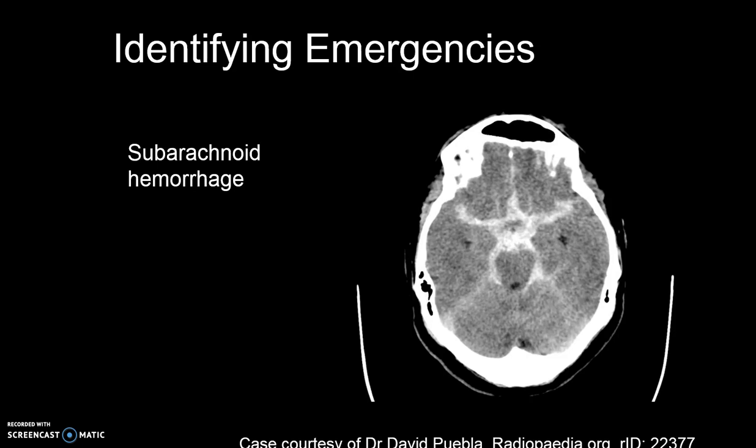There are two types of subarachnoid hemorrhages: traumatic and aneurysm. The hyperdensity around the circle of Willis is easily recognizable here. Remember, this is a neurosurgical emergency. For aneurysms that cause a subarachnoid hemorrhage, act quickly so the aneurysm can be coiled or clipped depending on the provider, age of the patient, and severity.